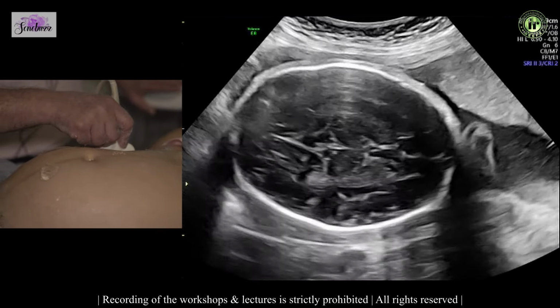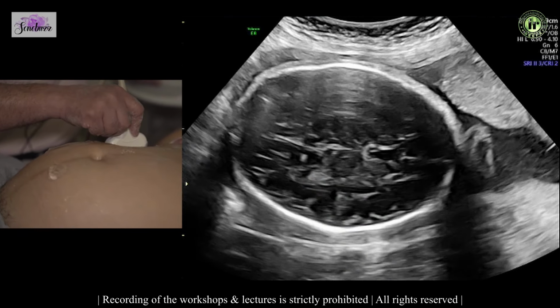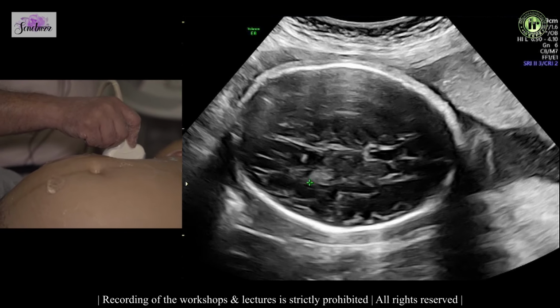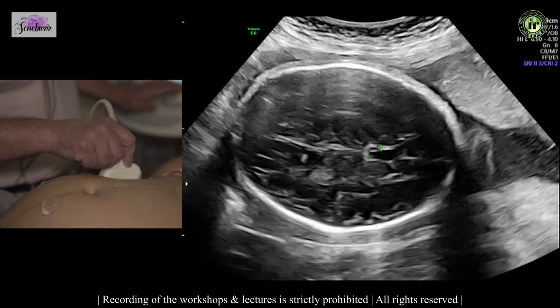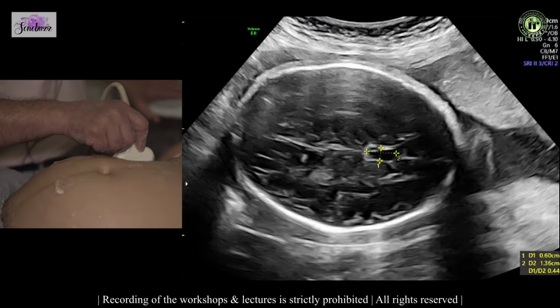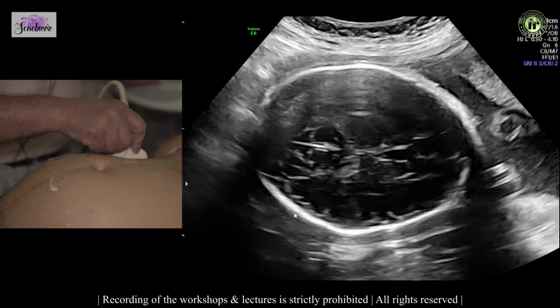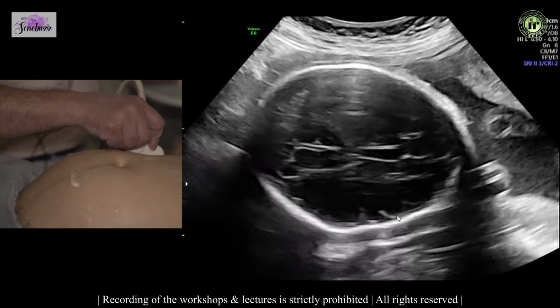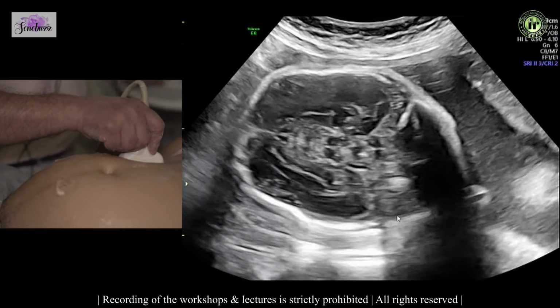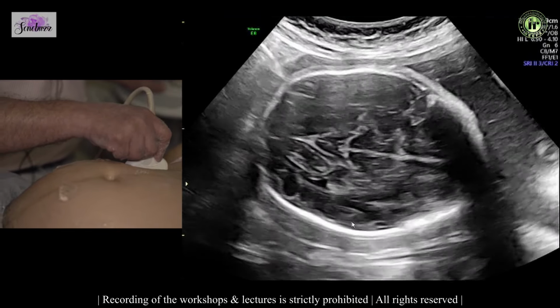We also look at the cavum septum pellucidum here, which highlights the fact that the corpus callosum is intact. We can measure a ratio. That's the diameter of the cavum septum. We can see the sulcations high in the cortex. They're all intact. And as we go down at the transthalamic level, we see that the Sylvian fissure is closed.